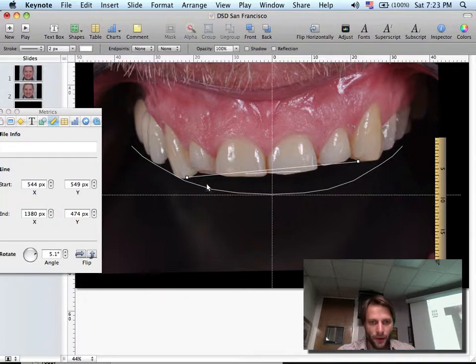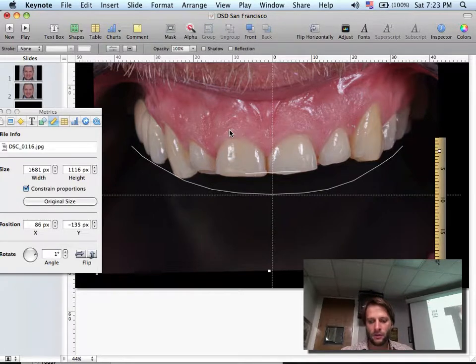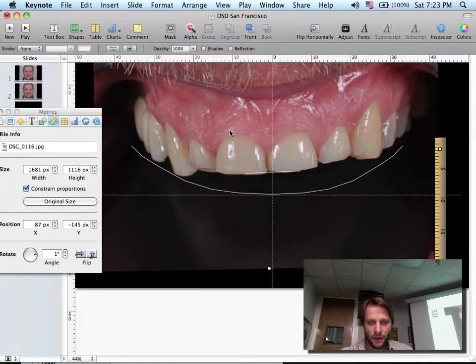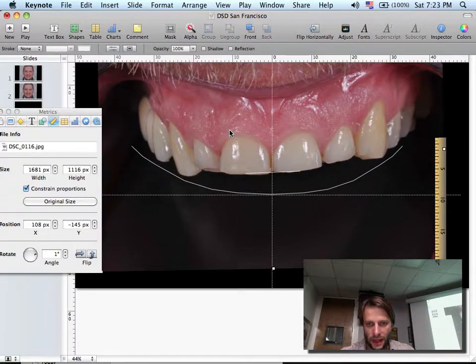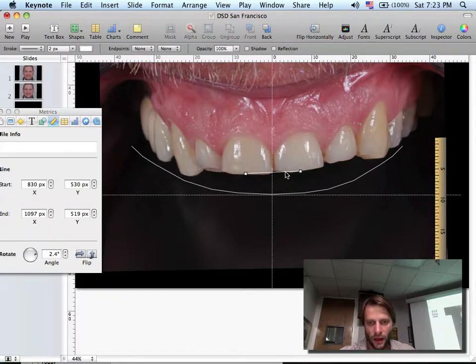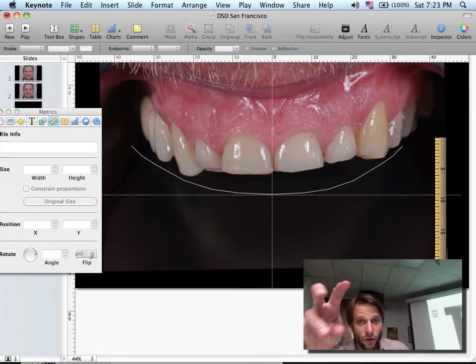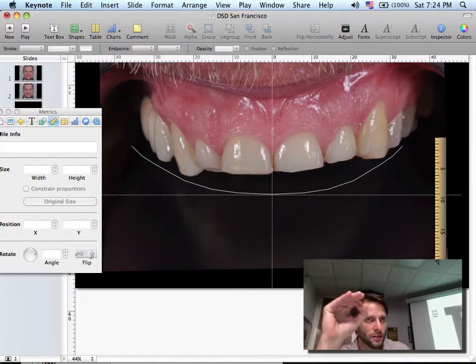That's fine. But I'm going to delete the line over the cuspids, and then I'm going to move. I'm going to click on the picture, and with the arrows on the keyboard, I will move up and down, right and left, until I match the midline and the incisal edge. And then I can also delete this little line, and then I have the intraoral picture calibrated in relation with the cross.